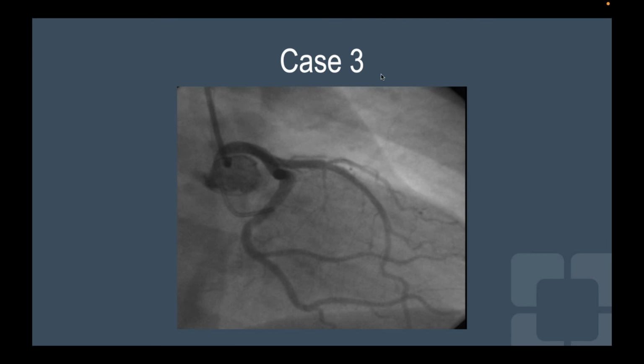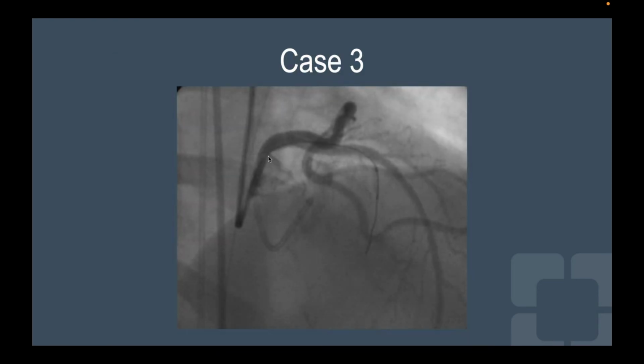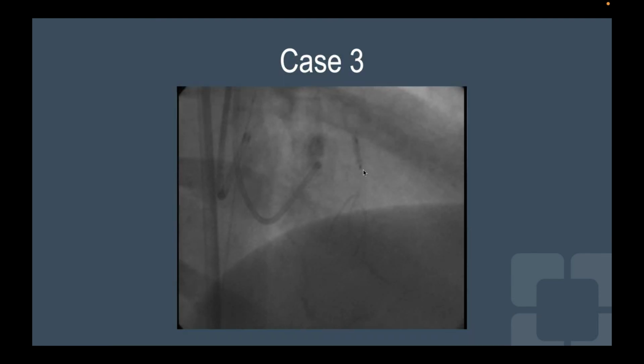So this patient had his left main injection, then it was selectively catheterized. You can see here a selective small wire going into the first septal perforator, and you can see the markers proximally of a small balloon that was inflated. Through that little catheter, with the balloon inflated, there is an injection of contrast mixed with alcohol. So you can see the septal perforator and its small branches in the septum as we were giving the patient virtually a small heart attack. These are done under anesthesia because they are terribly painful. Patients are actually having a heart attack by design. So it's a septal alcohol ablation to treat obstructive pathophysiology related to hypertrophic cardiomyopathy.